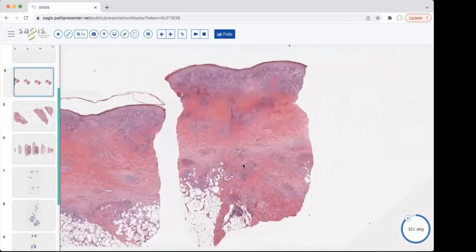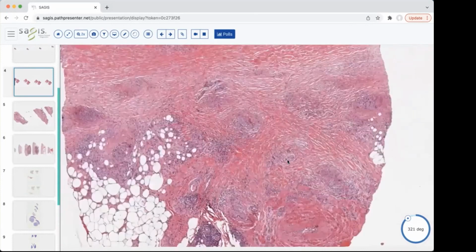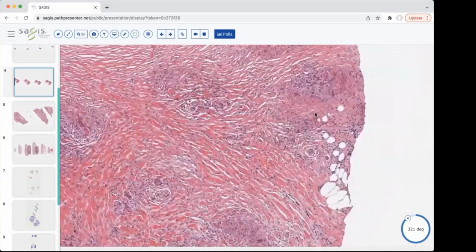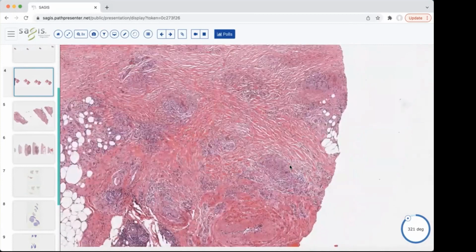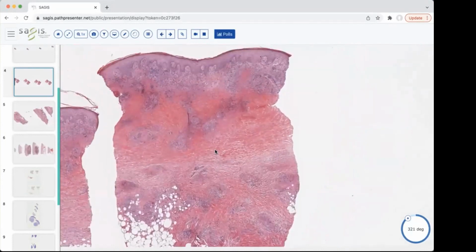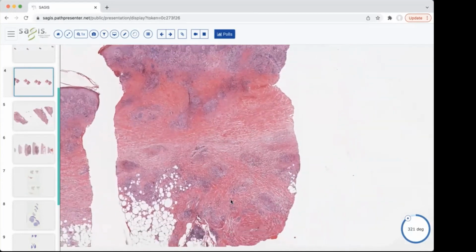In the past, it was called necrobiosis lipoidica diabeticorum, so you may still see that name sometimes, or maybe it'll come up on tests. But they've dropped that naming convention for several reasons. I think this is a nice example of that: a deep necrobiotic or collagenolytic, however you want to think about it, granulomatous infiltrate that has these layers, these cake layers.